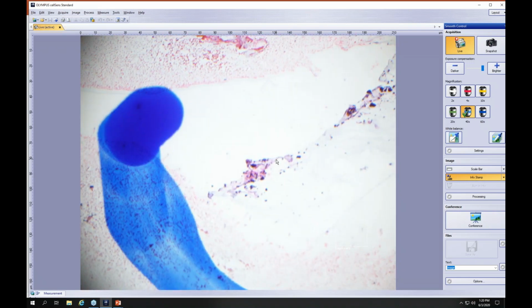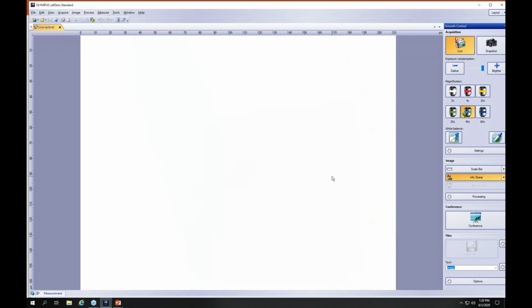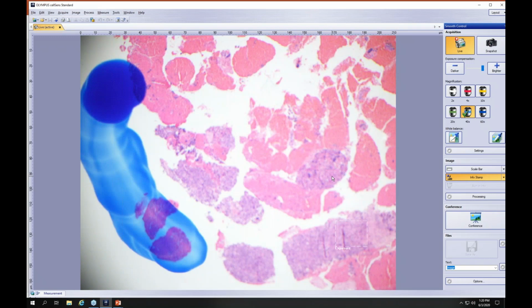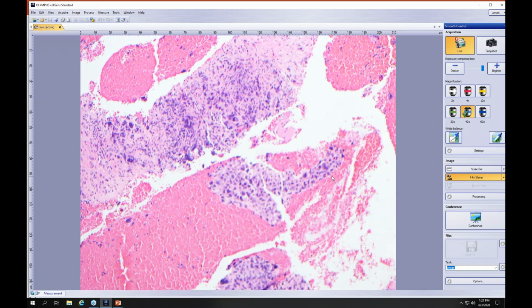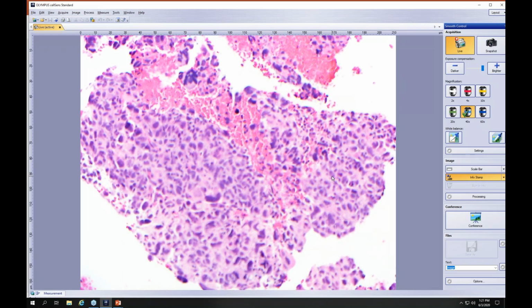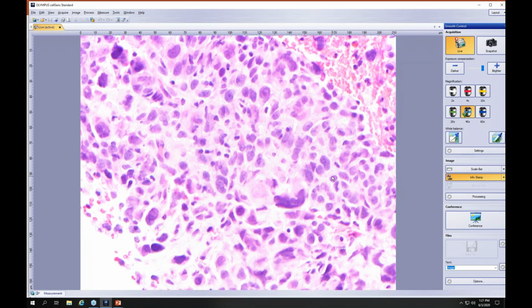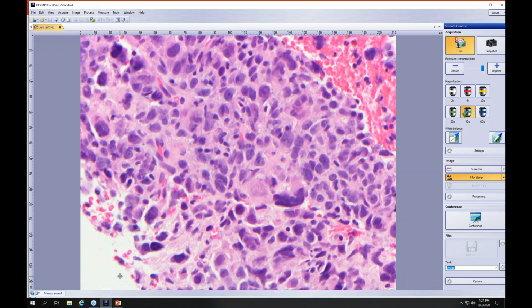Papanicolaou stain shows similar findings. These are cells that are multinucleated. They're actually quite large in presentation. So we got a cell block on this, which was extremely cellular. You can see the cellularity here on 10x, how cellular this specimen is. And then high power, just to show you the prominent nucleoli and irregular chromatin content. How bizarre some of these cells actually are.